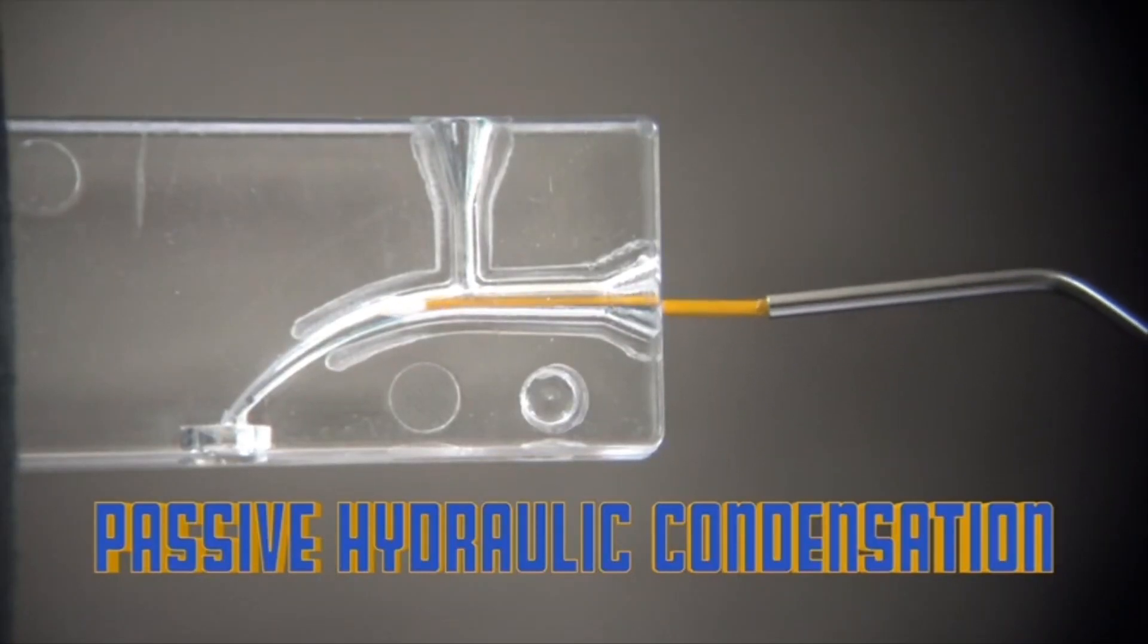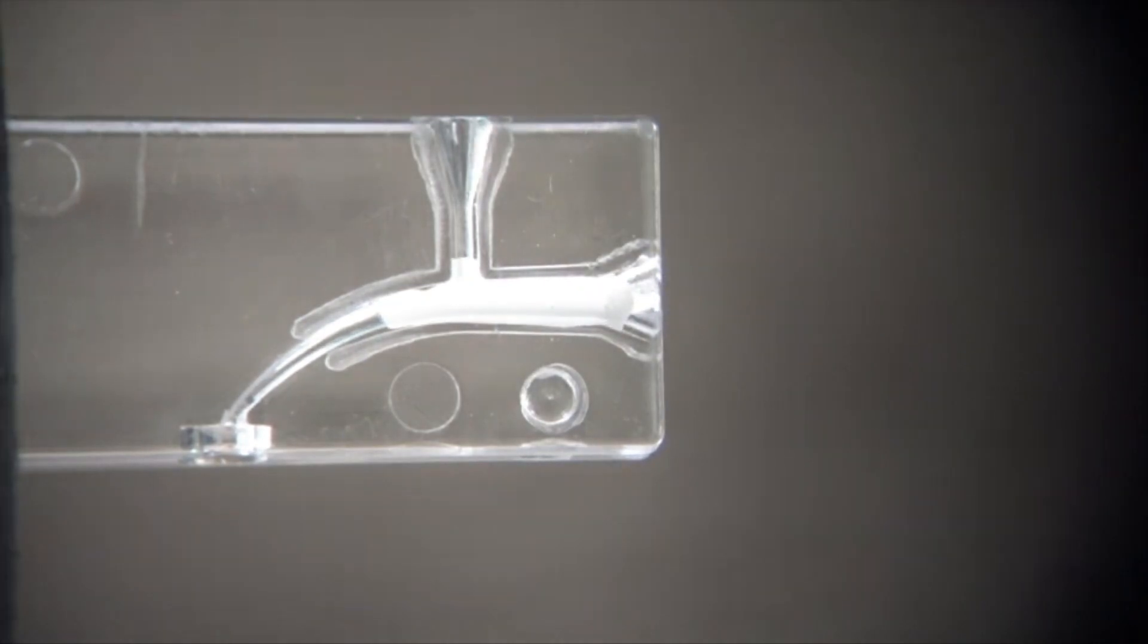In this demonstration block, there is enough room for only one cone. After placement of the sealer in the coronal half of the canal, we use a file to push the sealer to the apical area. This is an important step.